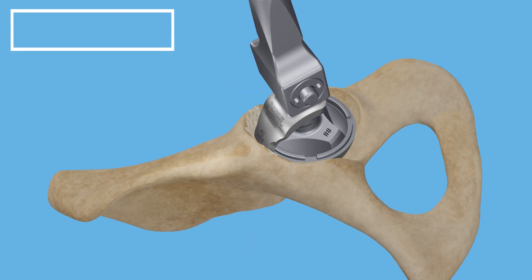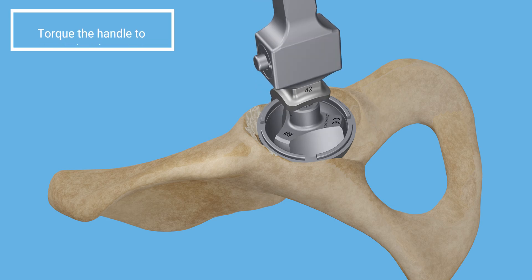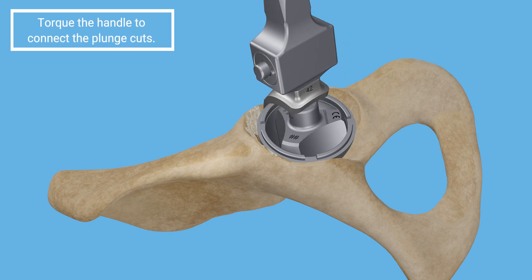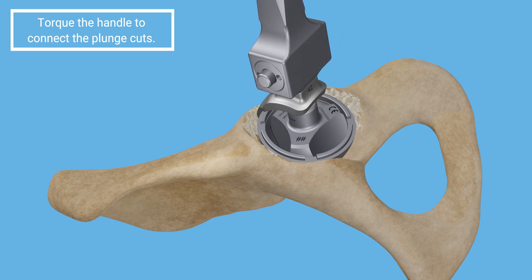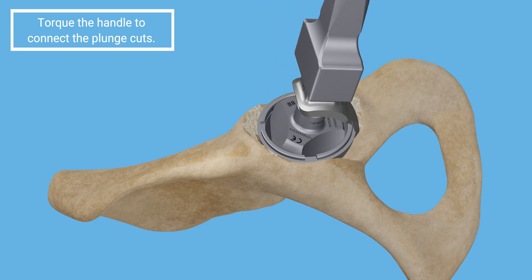After the final plunge cut, grasp handlebars and rotate to connect plunge cuts. If needed, repeat for additional cuts.